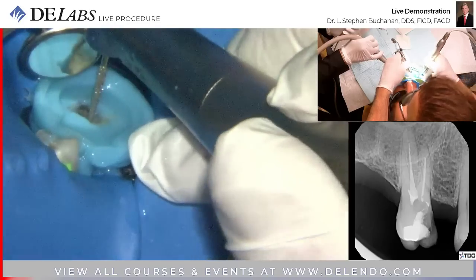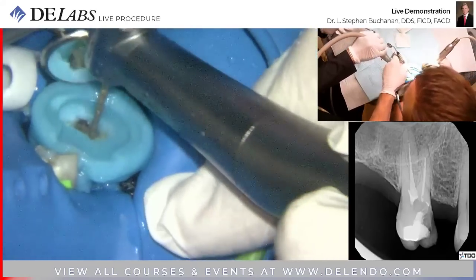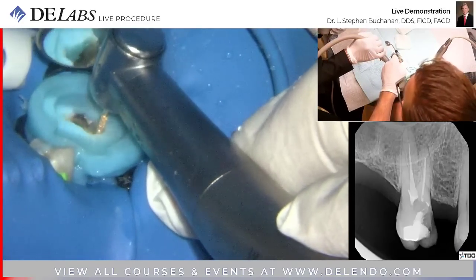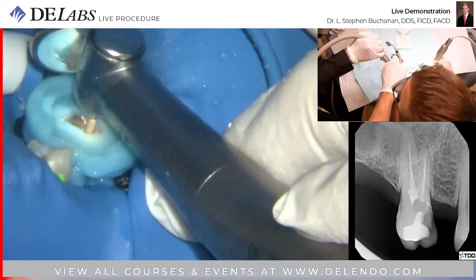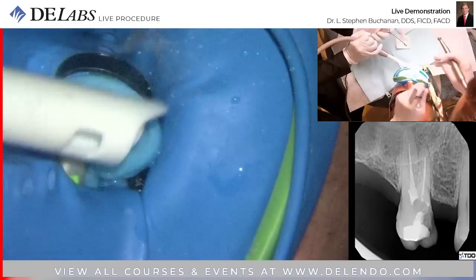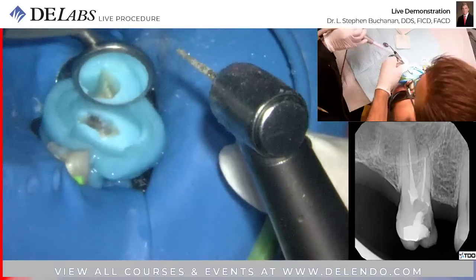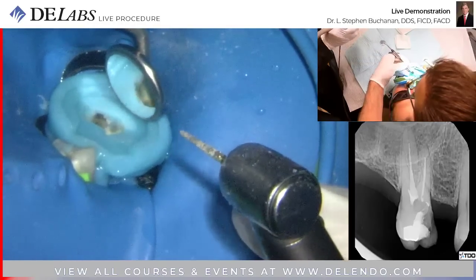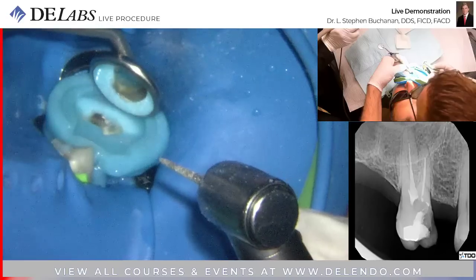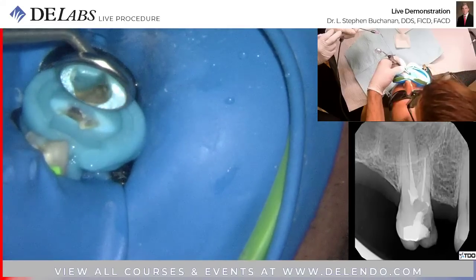We got what we need. I'm going to trim this back just a little bit. Okay. That is pretty good. I think I could use a little bit more on that corner there, but actually I don't think I need that. Okay.